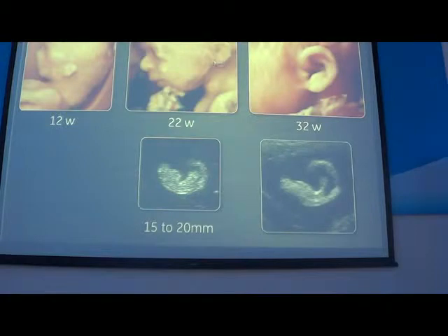At 22 weeks, the ear is round. And at 32 weeks, you can see clearly all the folds.